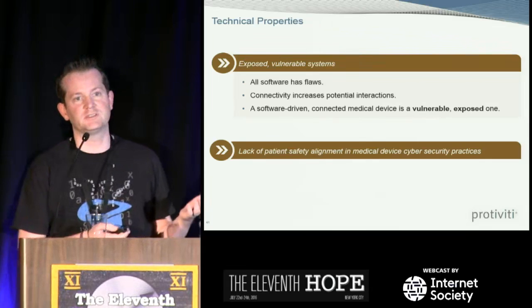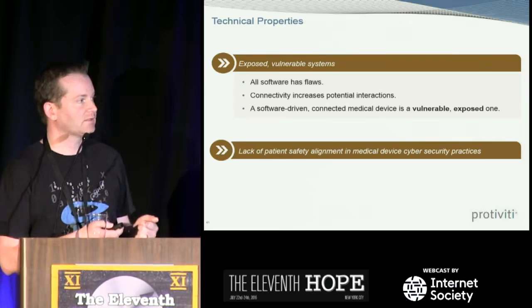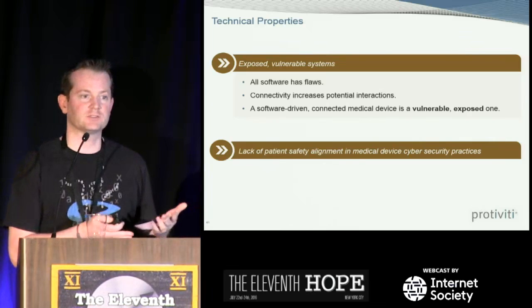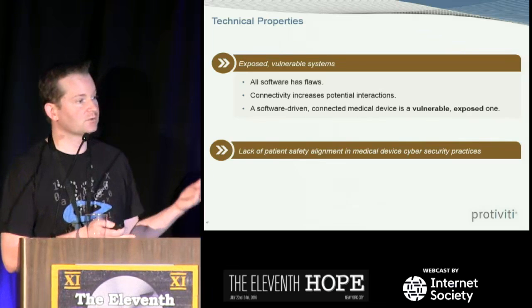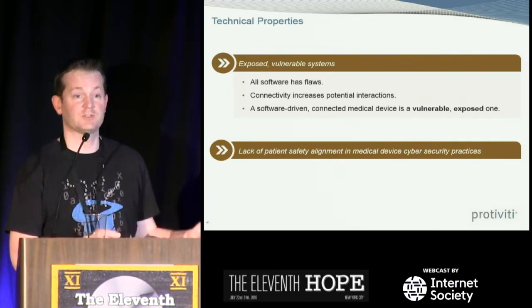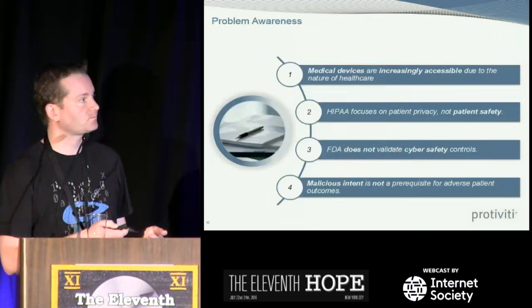And then also what we see is the lack of alignment from a patient safety perspective in terms of these medical device cybersecurity practices. We talked about this earlier, that HIPAA certainly is a driver, but in terms of the potential impact from a patient safety perspective, that didn't seem to be as much there.